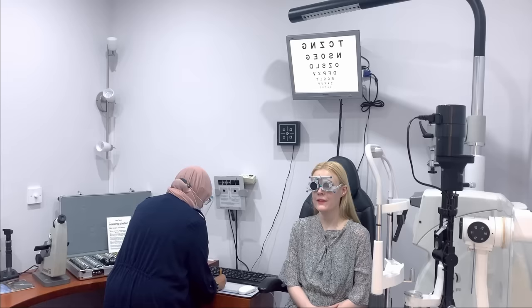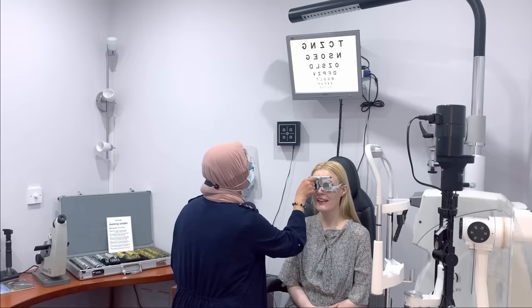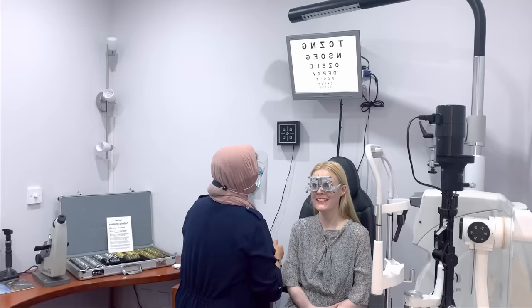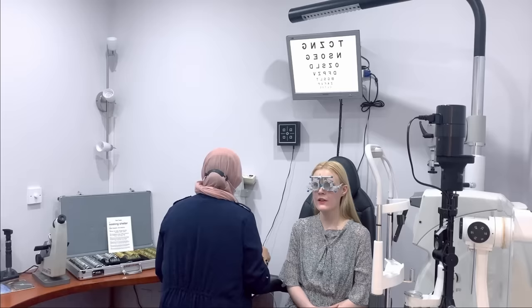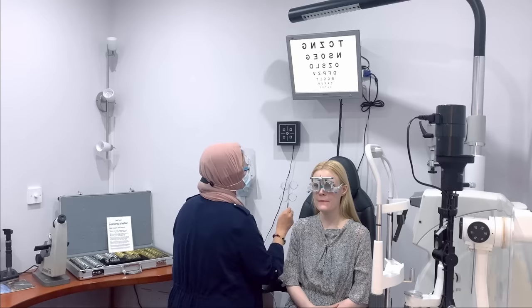Now, if I show it to you with both eyes, you ready? Okay. Blink, blink, blink, just to adjust to that. Oh, it's so clear. That's a lot sharper now, isn't it? So what I'm going to do is something called balancing, just to make sure the eyes are seeing well together. So looking at the bottom line there, if I place this lens on top, would you say it's just as good or better without?